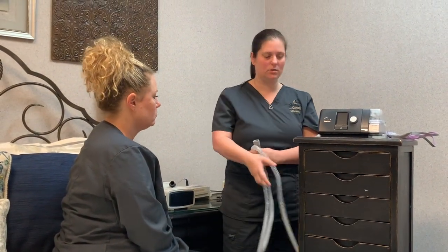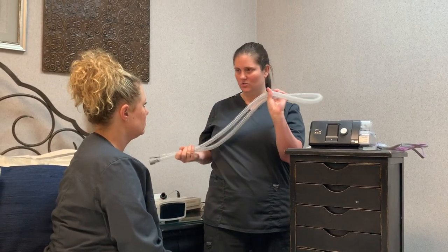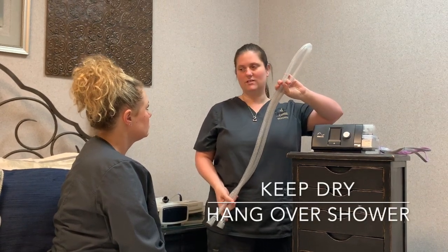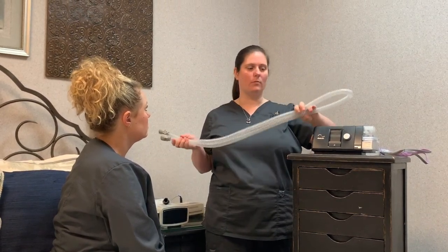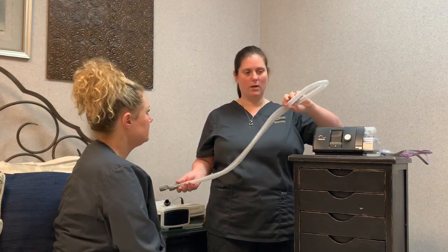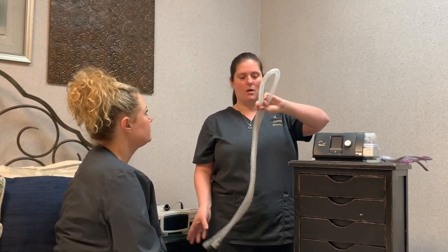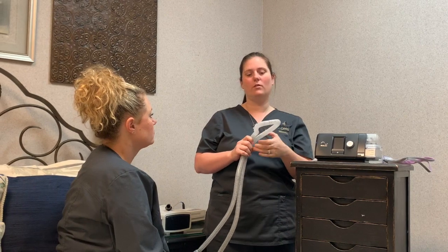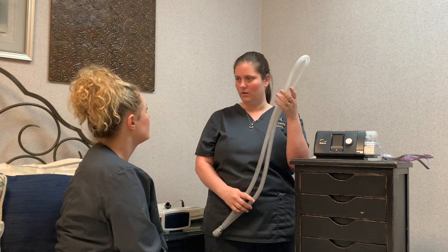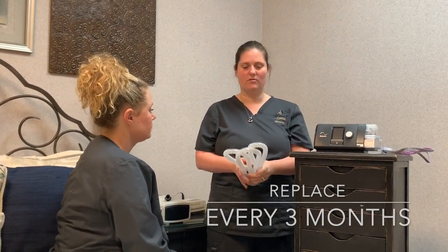It's just a standard six-foot tubing — both ends are the same. Just keep it nice and dry. If you get any water inside, hang it over your shower head. The reason you could get water is that you have warm air going through the tubing and cold air on the outside, which can cause condensation. You can also clean your tubing with warm water — just run some water through it and hang it over your shower head to let it dry. Replace it every three months.